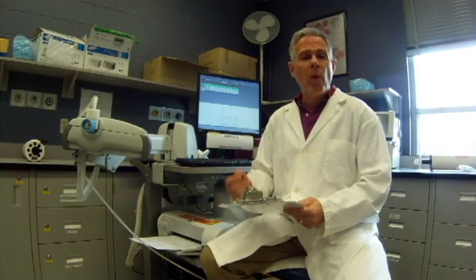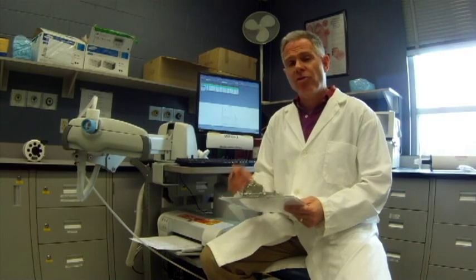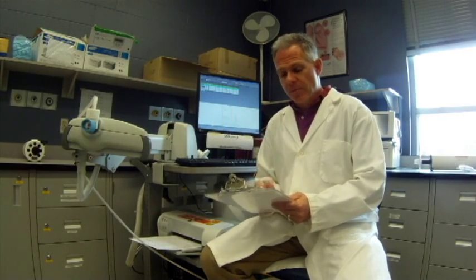Hi, my name is Alan Prost and I'm doing a short series of videotapes on how to do pulmonary function testing. This is the first part where we interview the patient and we're going to start off with a slow vital capacity test. Before we do that, we need to get information about our patient — their height, weight, name, and make sure their age is correctly documented, because we want to compare predicted values to their normal values and to the values we're actually going to test.